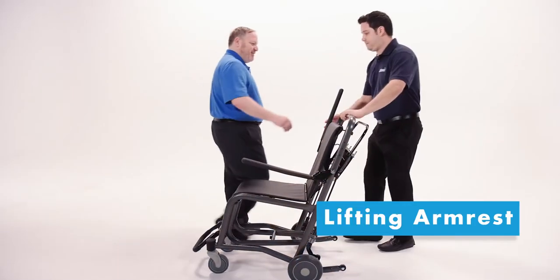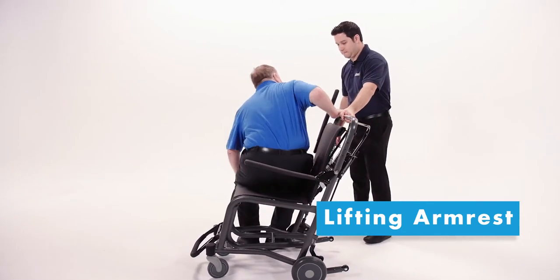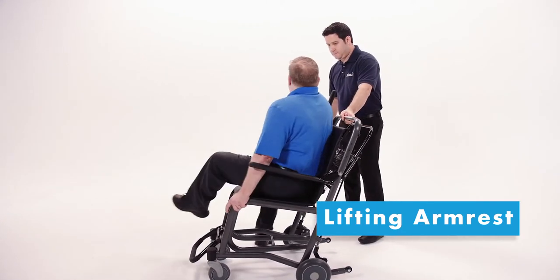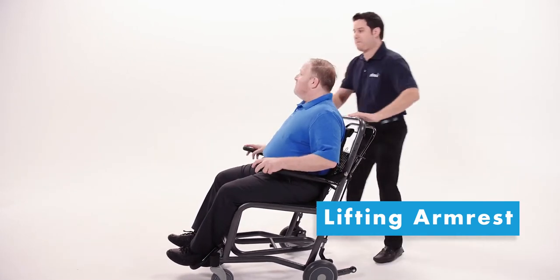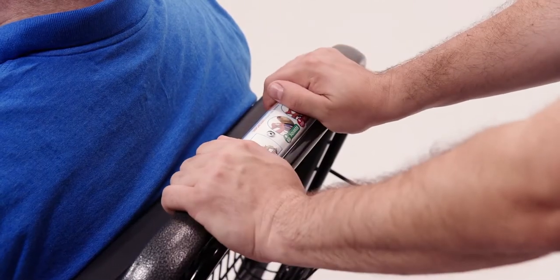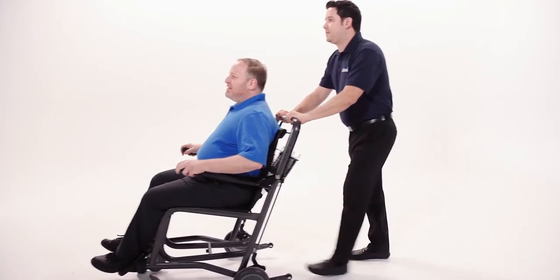The steel armrest has a non-porous antimicrobial sleeve which lifts for easy side entry and exit. The patient enters from the side and once in the chair, the occupant assumes a safe and comfortable position. This enables safe and stressless exit and entry.